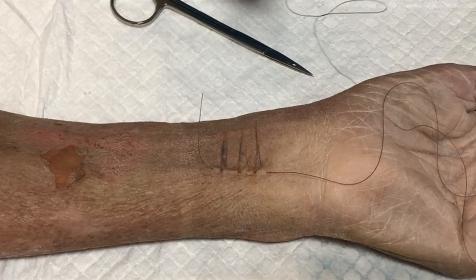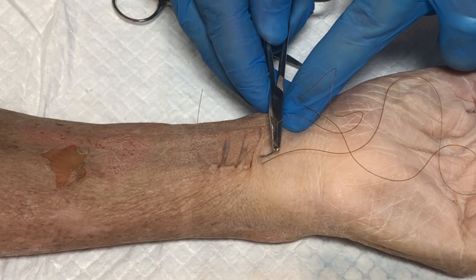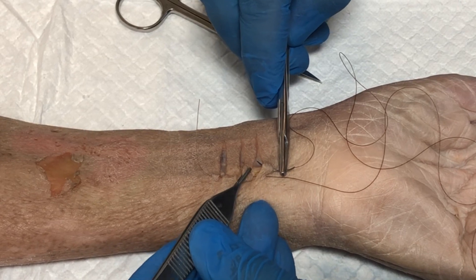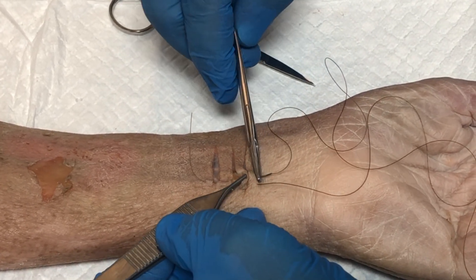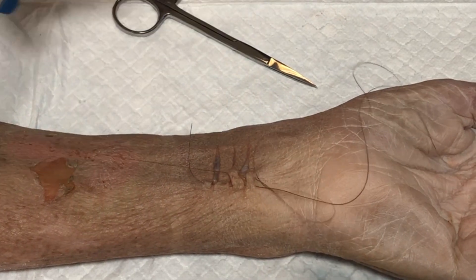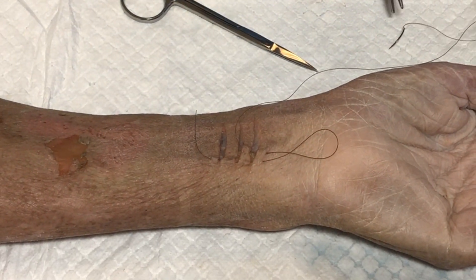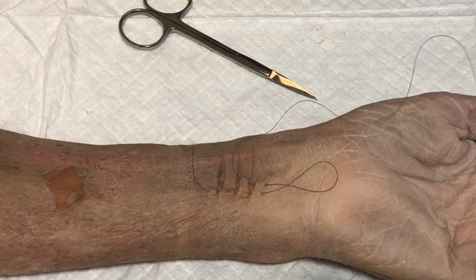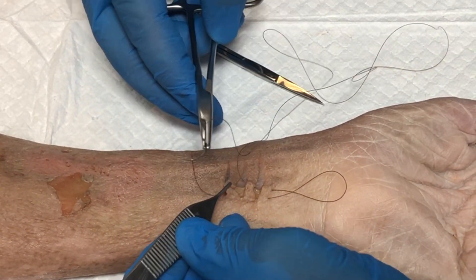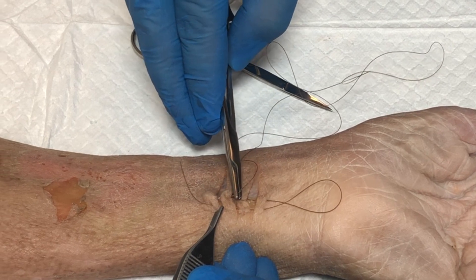Reload the needle driver and then come back in the opposite direction. Put the first pass right through here, using the tissue forceps to stabilize the tissue, pass it through, and use the needle driver to grasp the needle and pull through. Use the tissue forceps to expose the tissue properly right where it needs to be, and then come back through at the end.